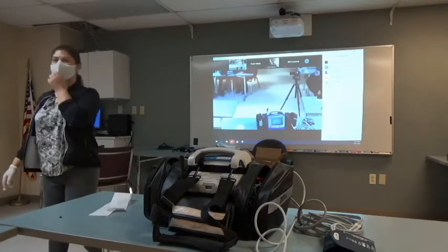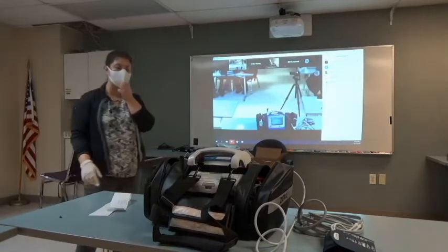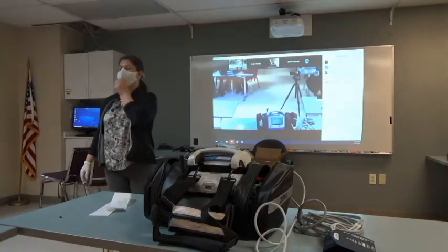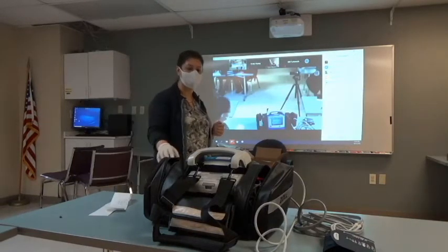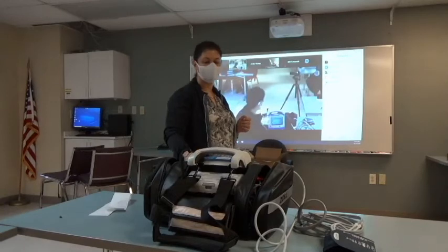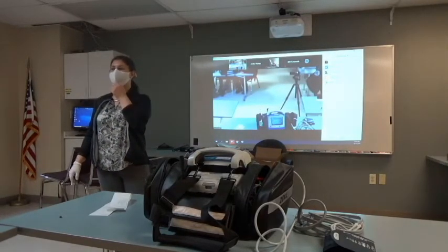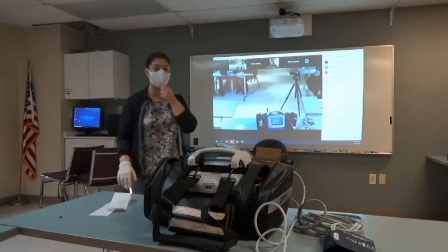The first question is, do you want to close the case out? The answer is yes. Go ahead and hit enter. The next question is, do you want to select a case? The answer is yes. Hit enter. Which case do you want? The newest one is up at the top, so we're going to hit enter.